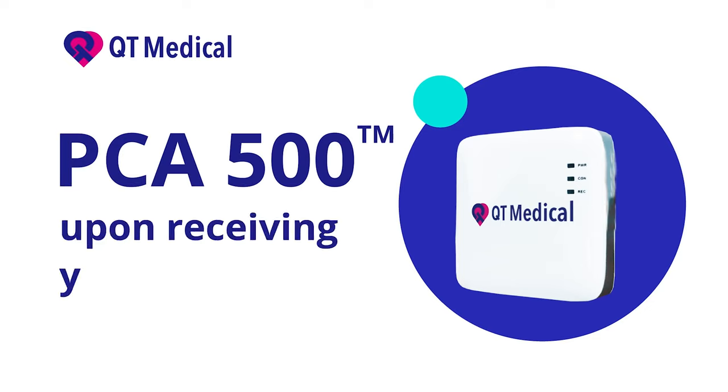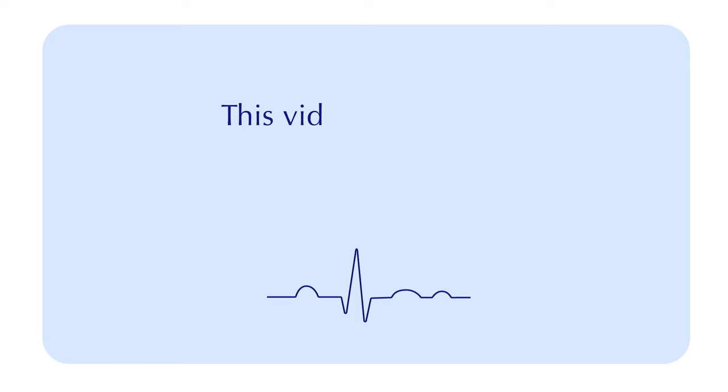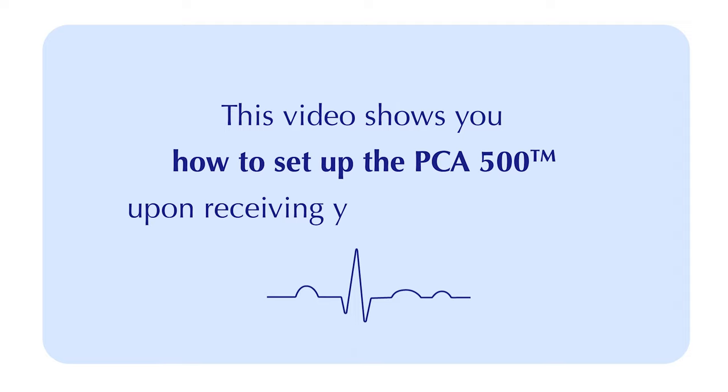This video shows you how to set up the PCA 500 upon receiving your starter package.